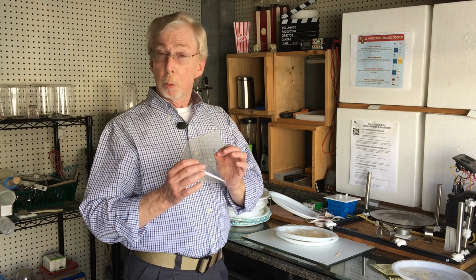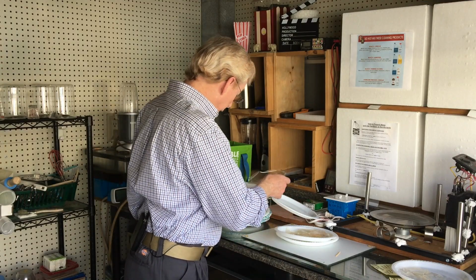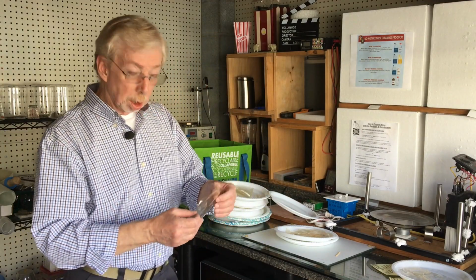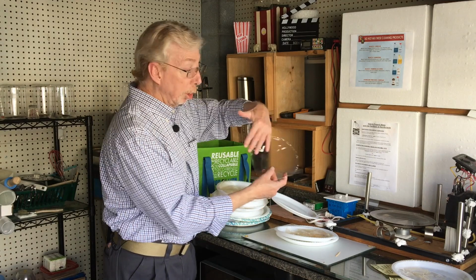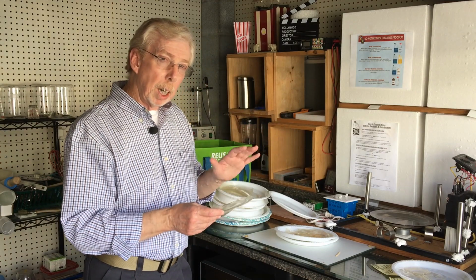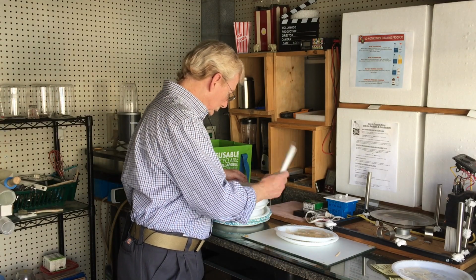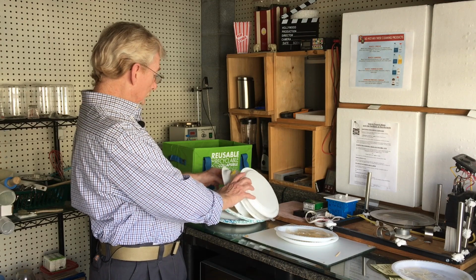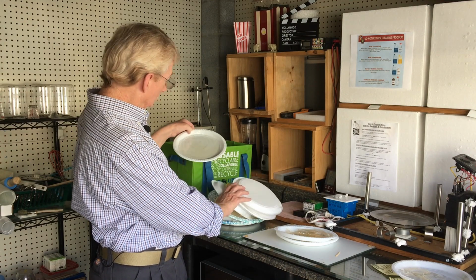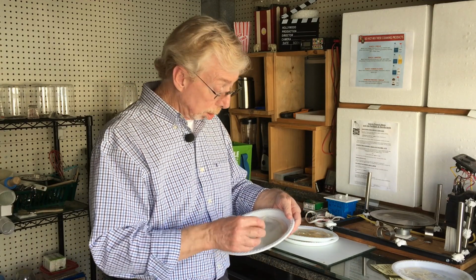This sample size is also more thick. This is 25 milliliters. This one is 20 milliliters. Now, as you can see, they're a bit bumpy, and these can be straightened out under a dry iron, put it between towel. And here's a slightly more thick version of the last mix, which was the 4 milliliters of glycerin.